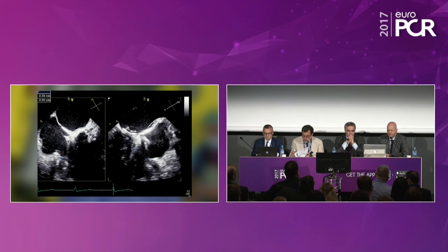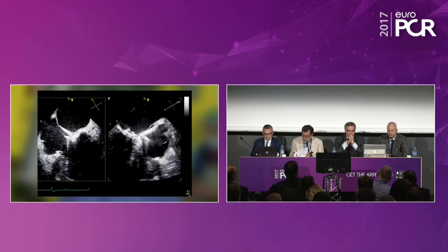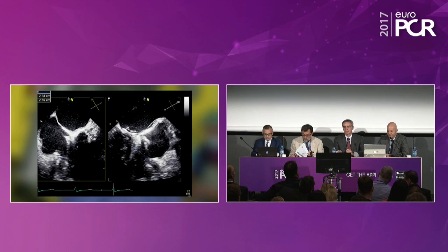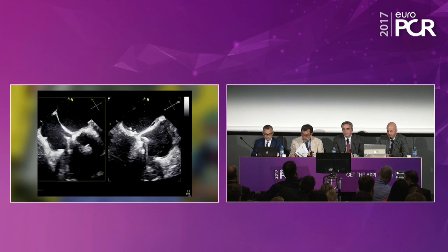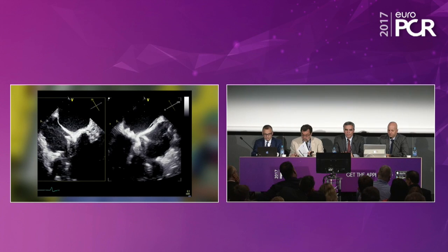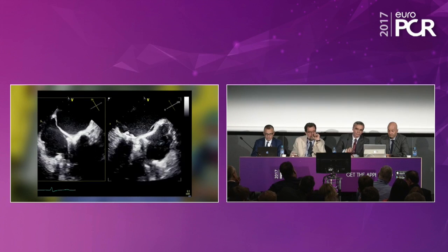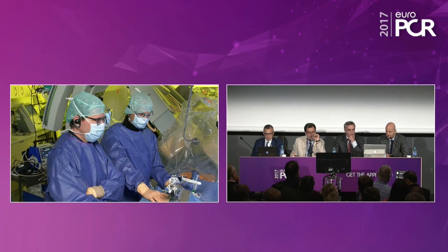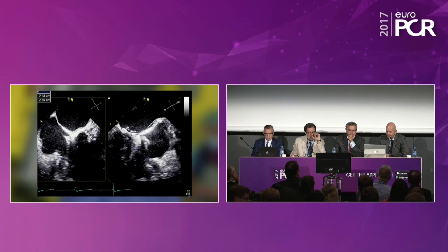And here we foreshortened the distance from 41 to 23 millimeters. Maybe I can go back for a second so that you can see this, that we are not just talking, but this is real. I showed you before that we have 41 millimeters of distance here, and this is foreshortened to 23 millimeters. So you just point to the Cardioband. You see nicely the Cardioband there. Let's go back. This is the Cardioband here. This is just a cut through the Cardioband here and here on that side. And you can also see it here and here.